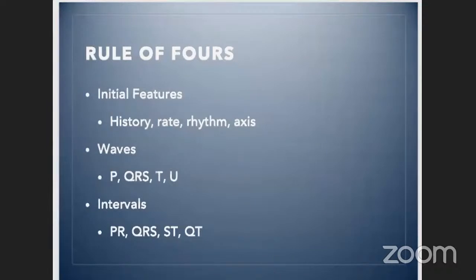I think that in primary care, we often find excuses, for lack of a less subtle way of saying it, to not do ECGs, either because we would have to do it ourselves, or the machine was dysfunctional last week, or we couldn't find leads, or we don't know how to interpret it. It really is considered a standard of care, and so it's not defensible to not do an ECG when it is indicated.